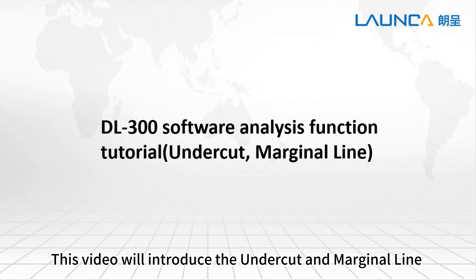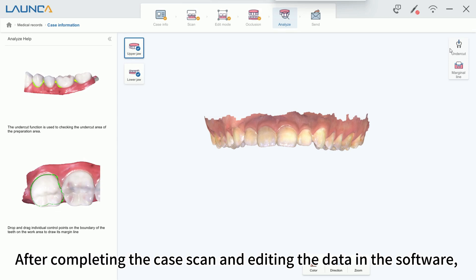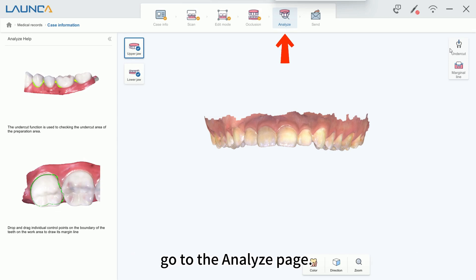This video will introduce the undercut and marginal line functions in the Analyze interface. After completing the case scan and editing the data in the software, go to the Analyze page.